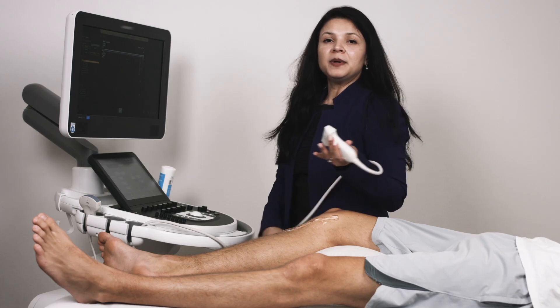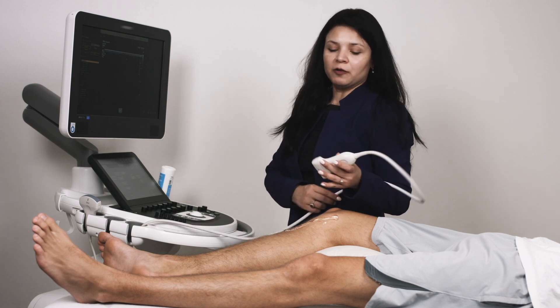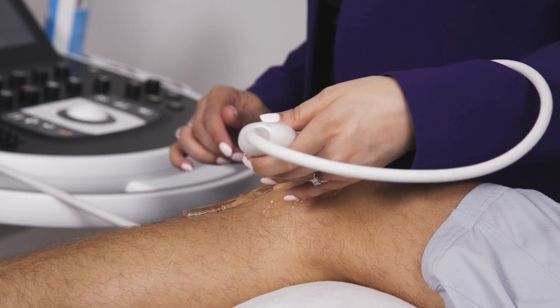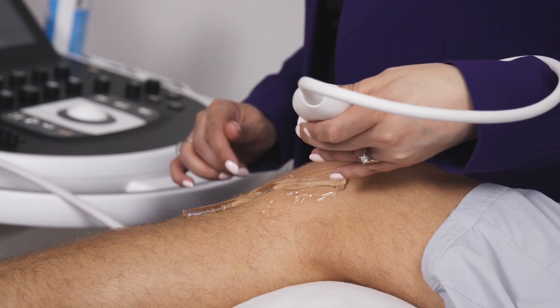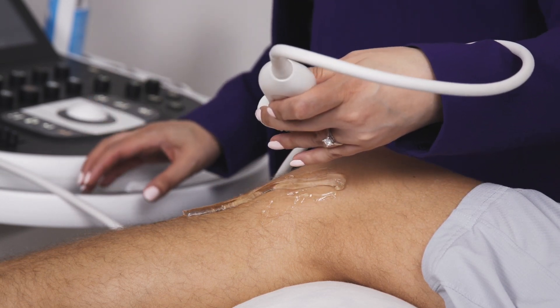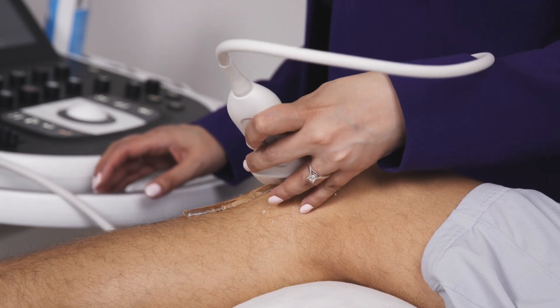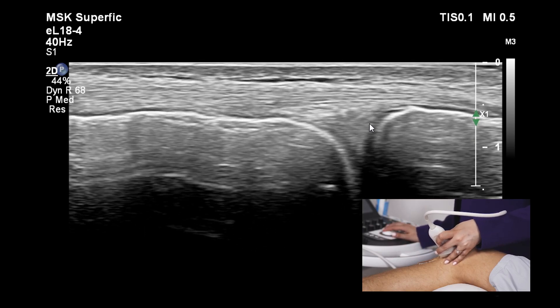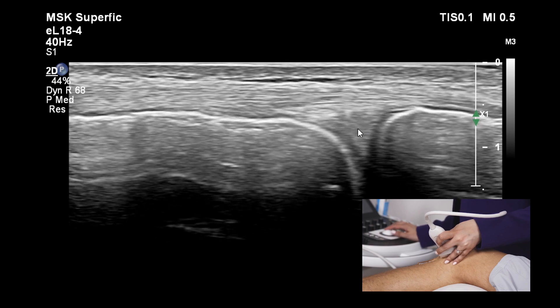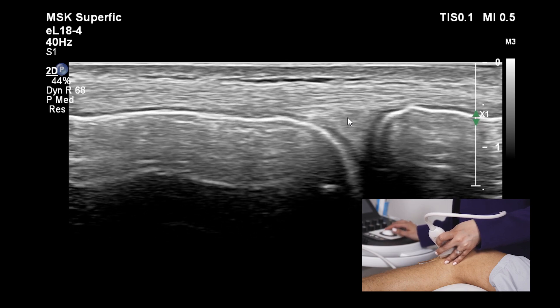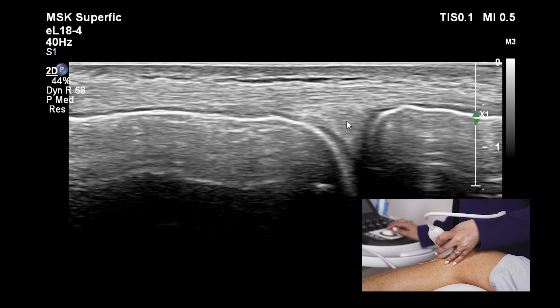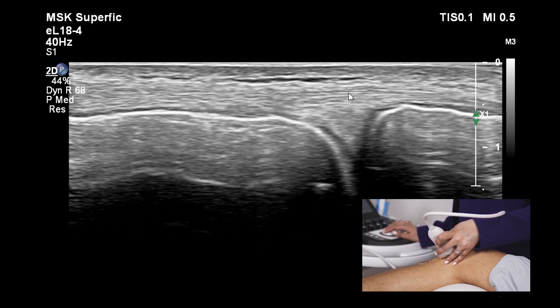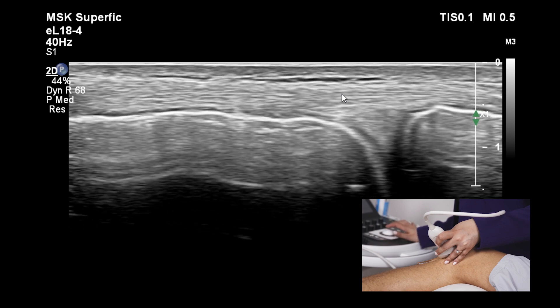Let's look at the medial collateral ligament in longitudinal view. To find the MCL, we keep the probe in long-axis orientation along the ligament fibers on the medial aspect of the knee. We first identify the medial joint space — on the left is the femur, on the right is the tibia. Between the two bony interfaces, we have the medial meniscus, and just outside it, we can see the fibrillar pattern of the medial collateral ligament.